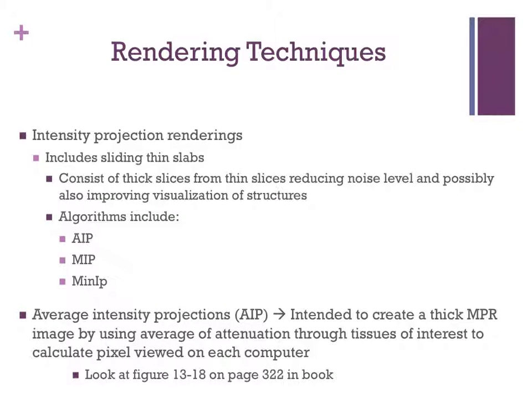Processing of image data from 3D space can also generate intensity projection renderings. This includes sliding thin slabs. Sliding thin slabs consist of thick slices from thin slices, reducing the noise level and possibly also improving the visualization of structures.